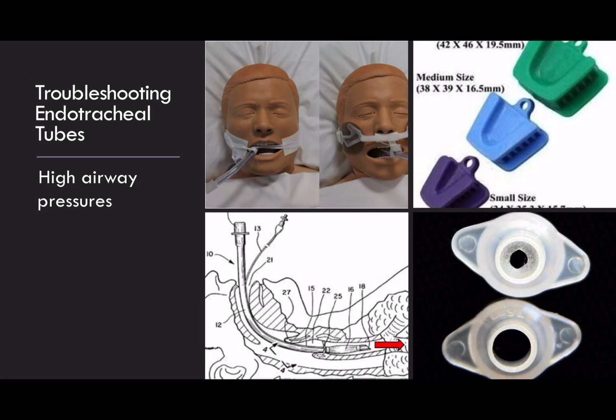If you imagine where the tube is, you can see on the top picture the teeth are sitting just around the tube, and if the patient becomes light, they may start to bite on the tube, thus occluding it. If you remember what we talked about with the diameters of the tube, the smaller the diameter, the higher the pressure, and that's what the ventilator might be detecting, because the caliber of the tube is reduced because the patient's biting down.